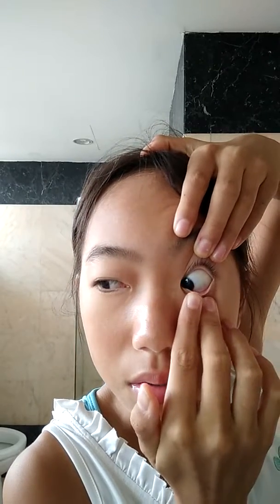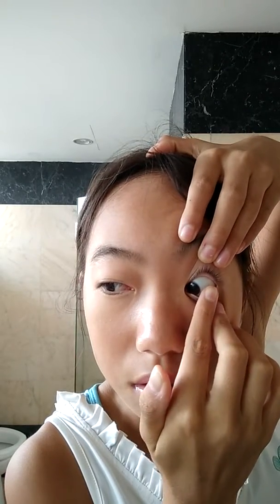Once you've got it, take your middle finger, look towards your nose, and pinch it out. It's really easy. Close your lenses and then you can discard them away.